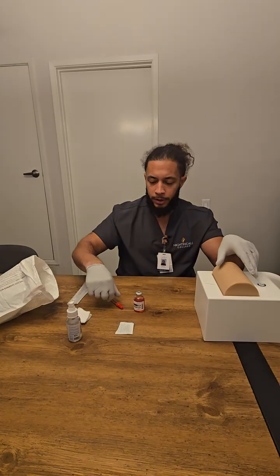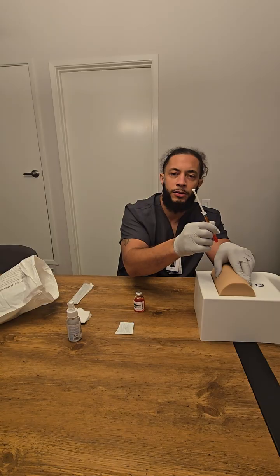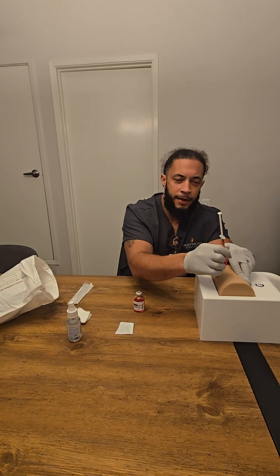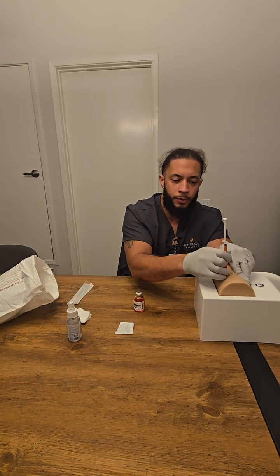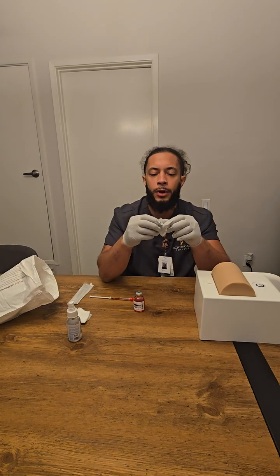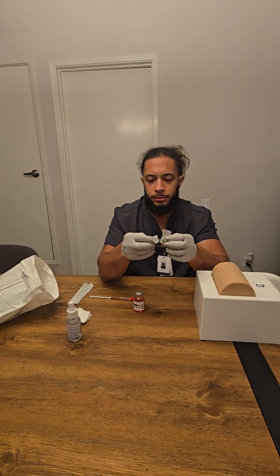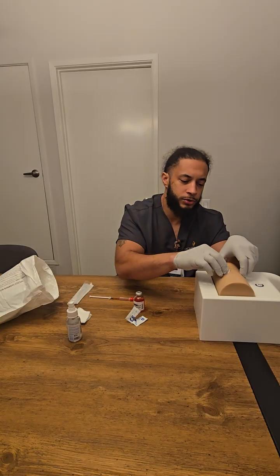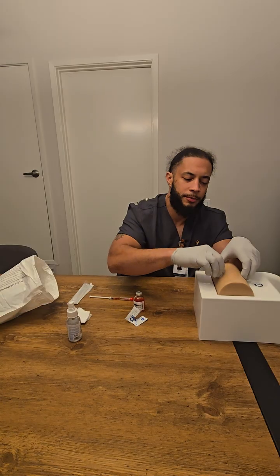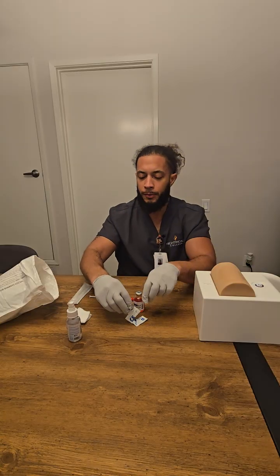Next, we're going to pinch the skin to make sure the needle goes in at least 1/2 inch of the skin fold, which it does. All right. Next, we're gonna clean the area in a circular motion, from the inside out, about 5 centimeters. And we just let it air dry.